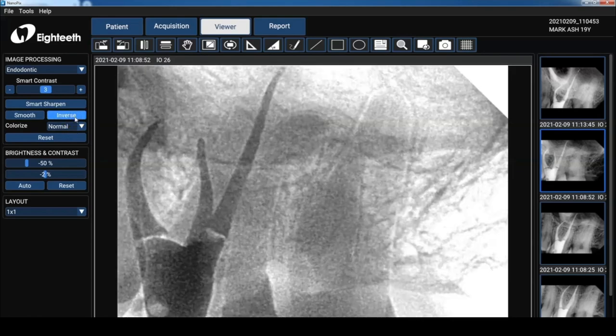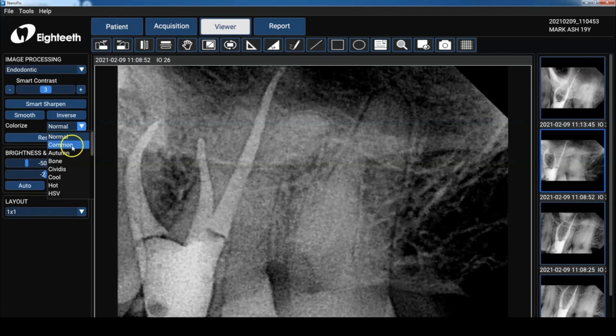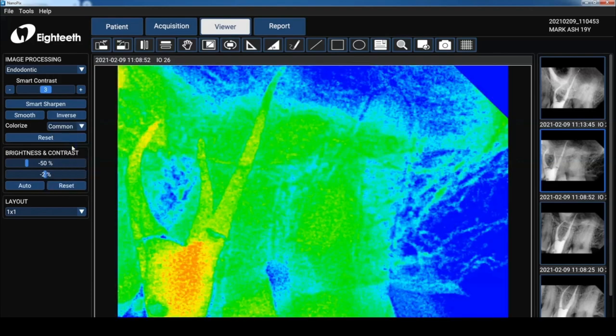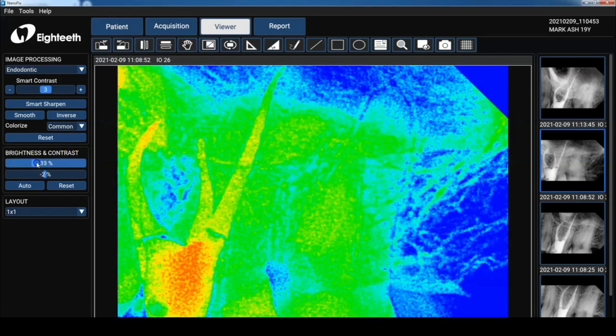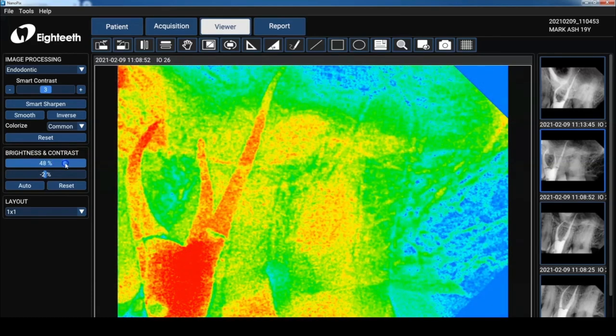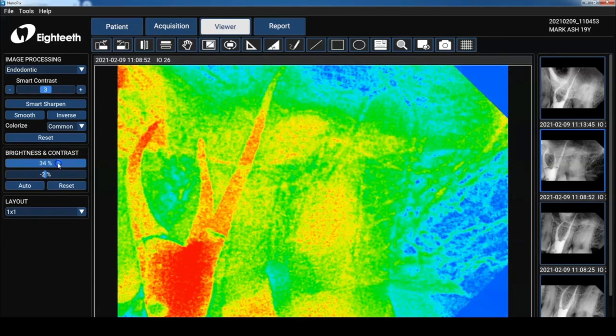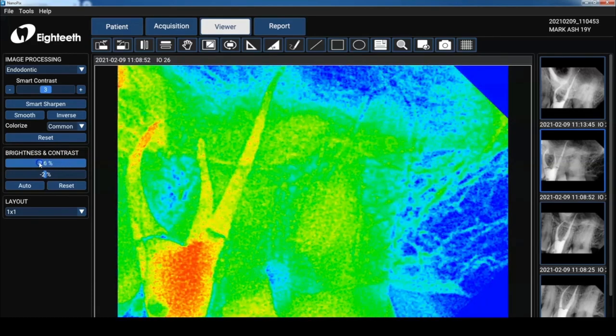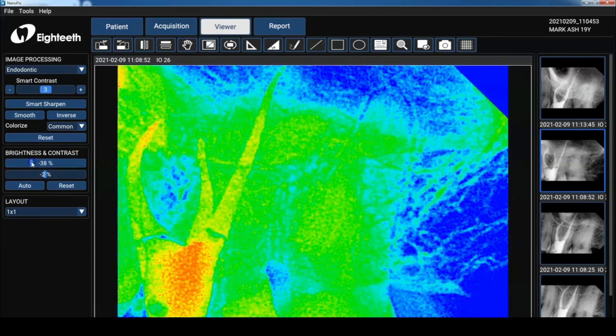So some of the colorized options are available there. And of course, using the brightness and contrast allows you to manipulate the different densities in the image. So I'm going to set that back to normal.